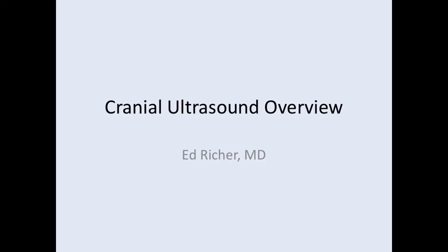Alright guys, this is another video for cranial ultrasound. This is a little bit of cranial ultrasound potpourri, a little bit about hydrocephalus, a little bit about structural abnormalities, a little of this and a little of that.